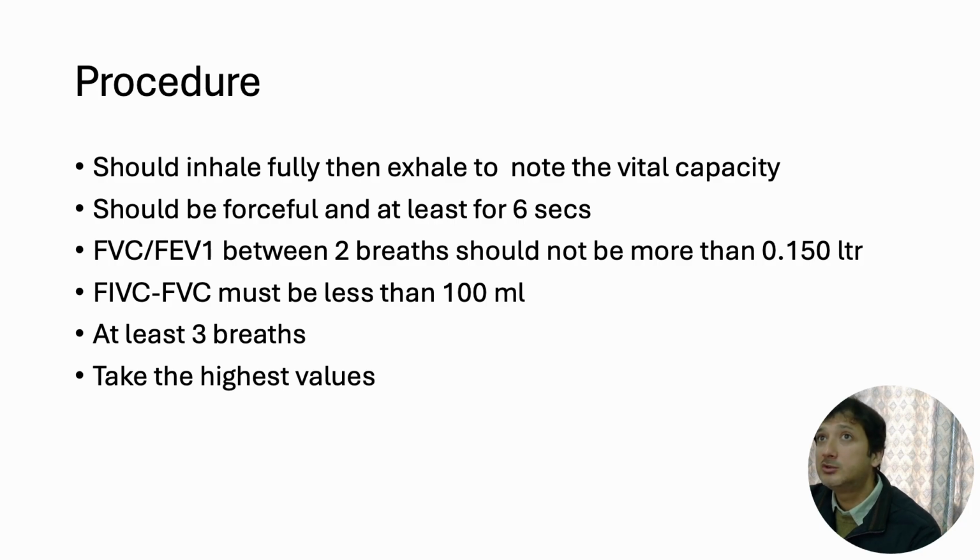So how is the procedure done? The patient is asked to inhale fully, and only then exhale, because we have to measure the vital capacity. Vital capacity means that after total inhalation, or total forceful inspiration, only then can vital capacity be measured. So this will be forceful, continuous, and at least 6 seconds. We have to ask the patient to exhale forcefully into the machine.